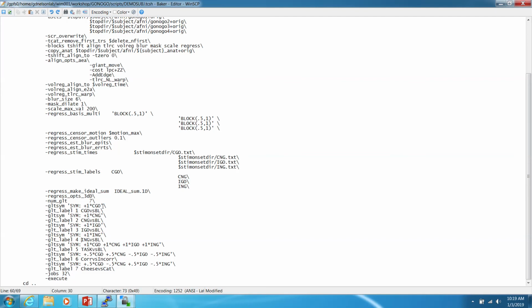So that's very easy in these simple contrasts. When we get down to the later contrasts, we have to balance things out, so you can incorporate, like here, multiple tests all together.